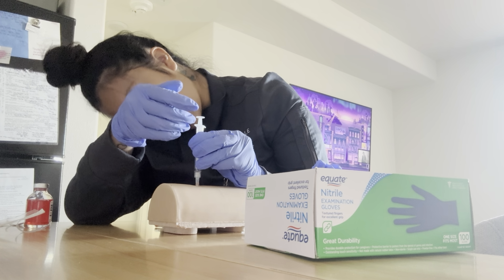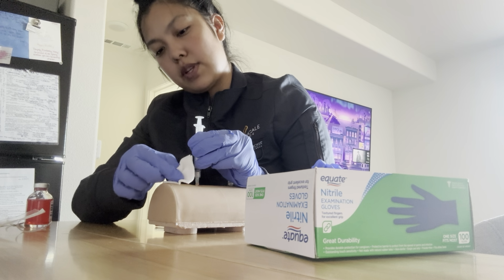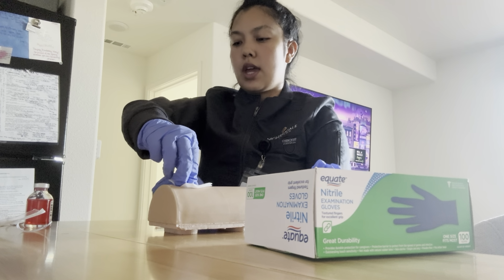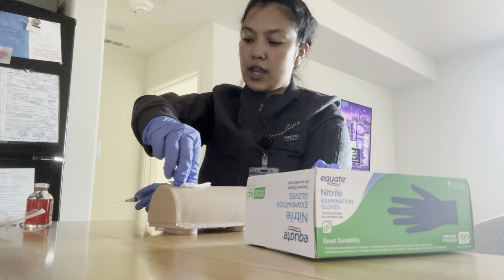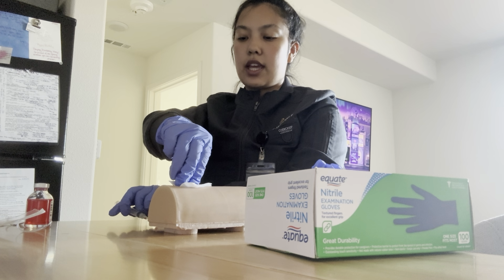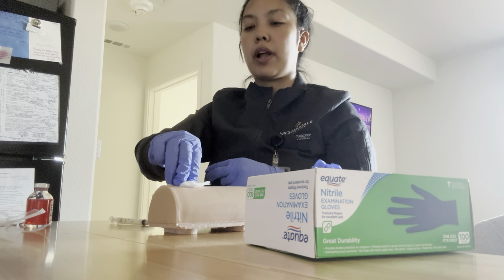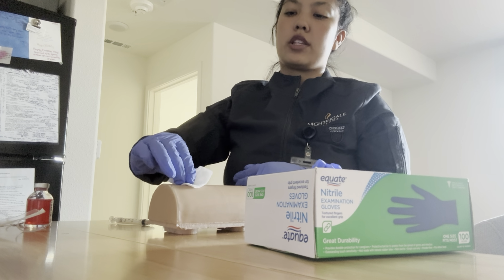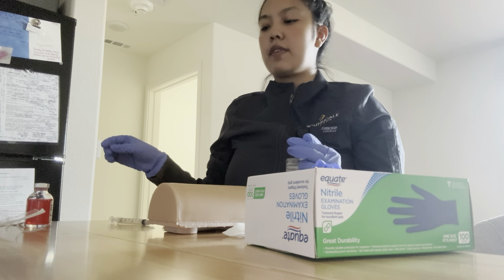Okay, perfect. So now I'm going to grab a tissue, and then I would cap it and throw it into my sharps container. Then I will apply a little bit of pressure. Once there's enough pressure, I'm going to take off the gauze and apply a Band-Aid if needed.